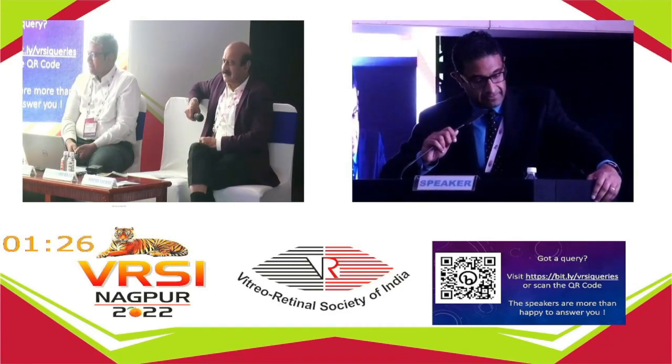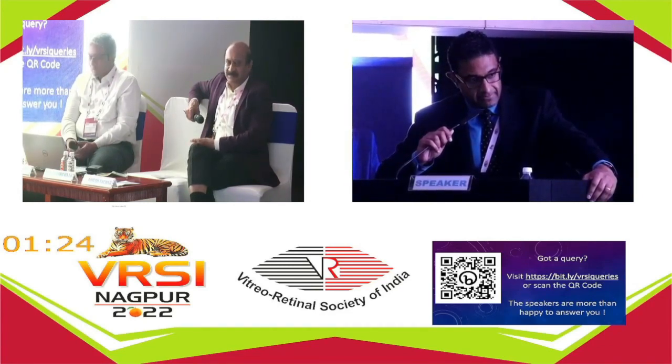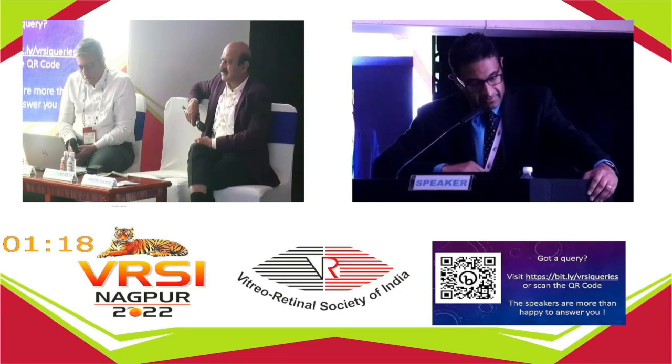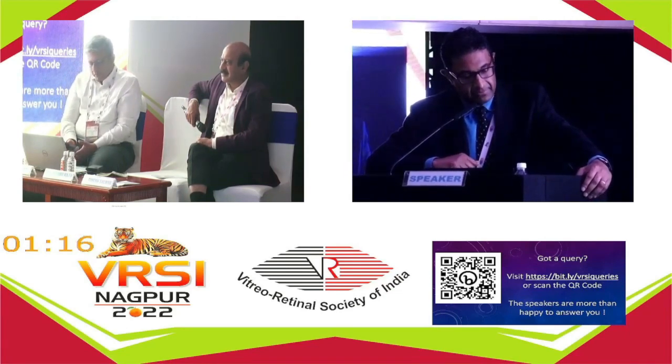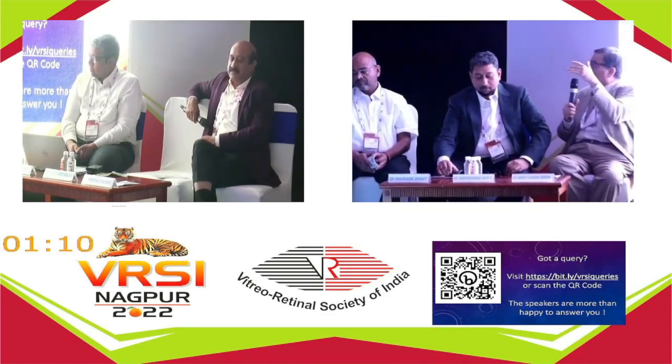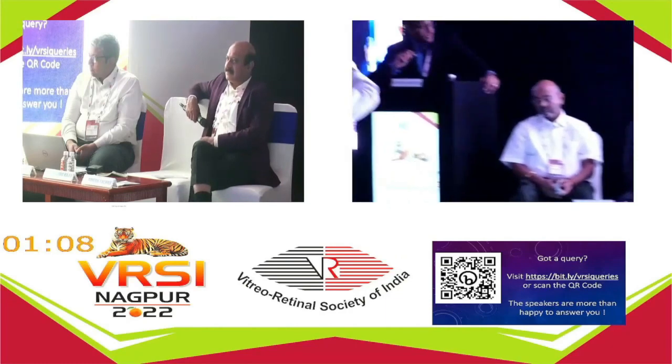But in terms of efficacy of detection of something, like progression, we do want to see the periphery. Can I not see that periphery? I'm asking you, I don't have a wide field. By making the patient look into the periphery, can I not get the same details of the periphery with a conventional camera? So I'm going to say no.